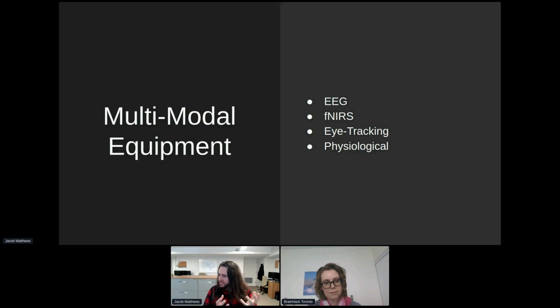If you don't need a particularly high resolution for the question you're trying to answer, don't use a higher resolution. You're going to lower your data SNR. Things are going to get harder for no reason. Same thing if you can design your task without much complication to not need as high a speed in your EPI, like your temporal sampling. There's no reason to push the boundaries on these things if your question doesn't demand it.